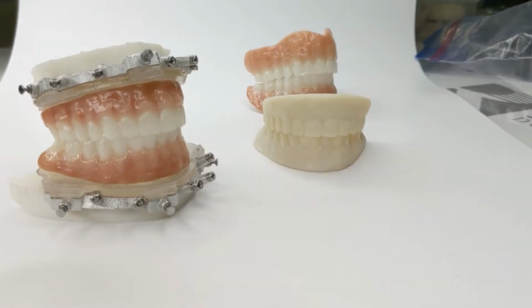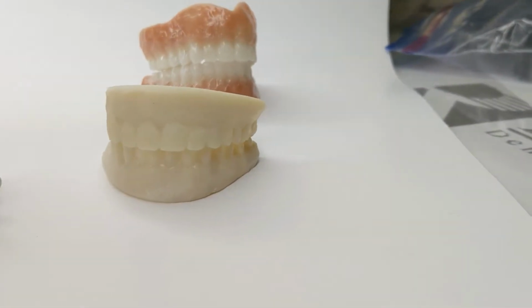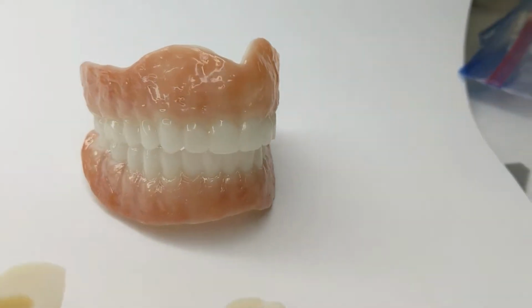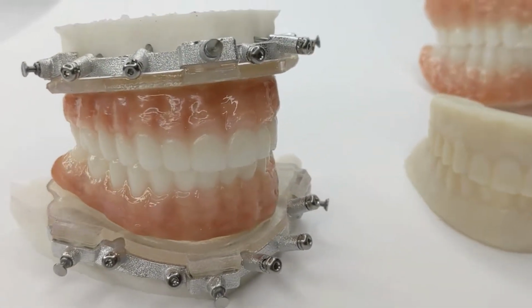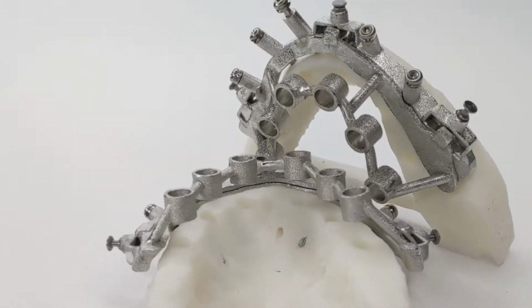This is the case we were just showing, where we were sending a pin guide in the first image, and then the surgical prosthetic in the second image. Here are the rapid appliances, and here are the backup dentures. The doctor wanted conventional dentures as one backup, but then also the milled PMMA dentures. And then here are the osteotomy guides and fixation bases.